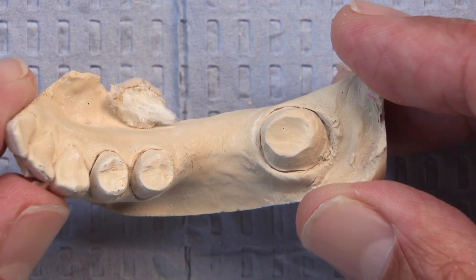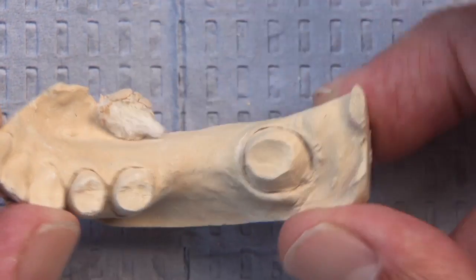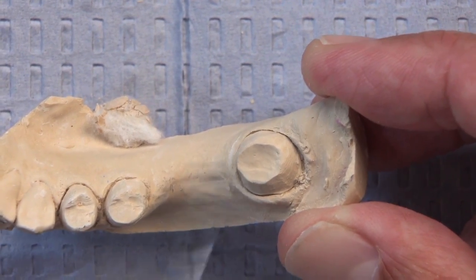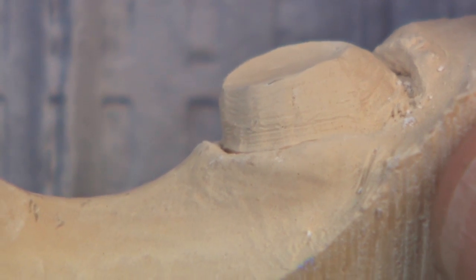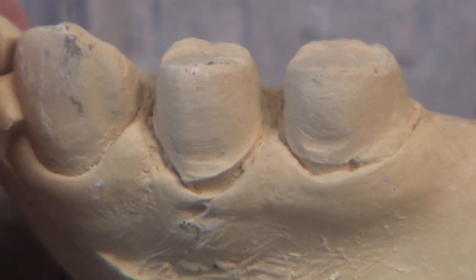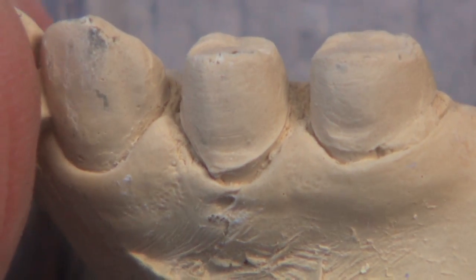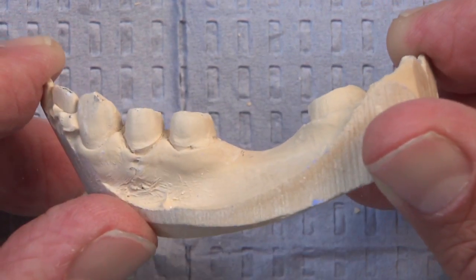It's very difficult on these wisdom teeth. It's a really common thing to have happen. And you end up almost knowing going into these that you're really going to have to over-taper this mesial wall if you're going to use that wisdom tooth as an abutment. But it's interesting because it shows pretty good hand control. If you look at the preparation and the smoothness of the burr marks, things actually look pretty nice around there, and it's not a super subgingival margin placement. So it's actually pretty decent.